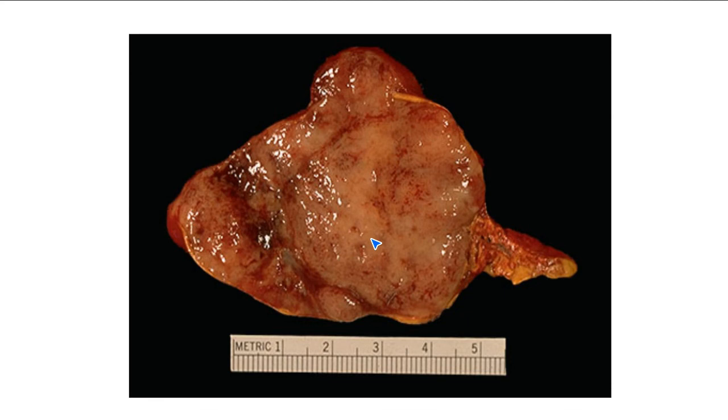Okay, so that's what you'd see under the microscope for these pheochromocytomas. We already made reference to the fact that the tumors produce epinephrine and norepinephrine. So this catecholamine producing tumor arises from the adrenal medulla and has that particular histological appearance. How would patients with this tumor present?